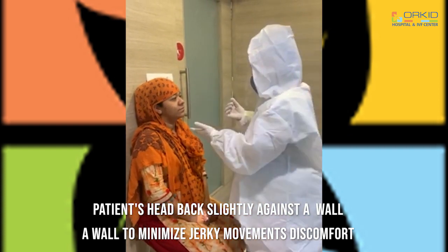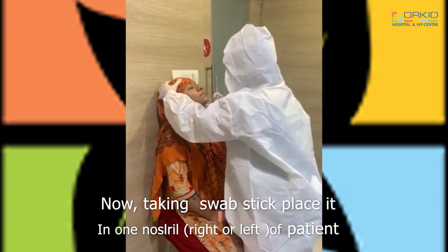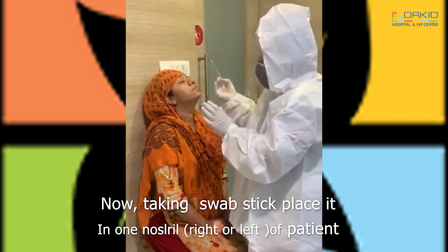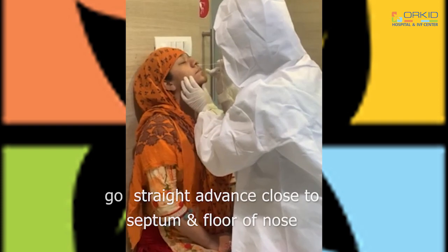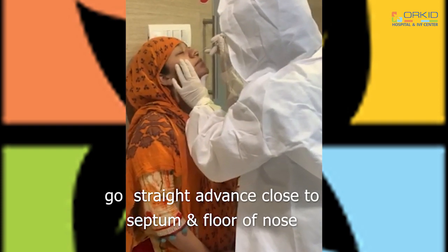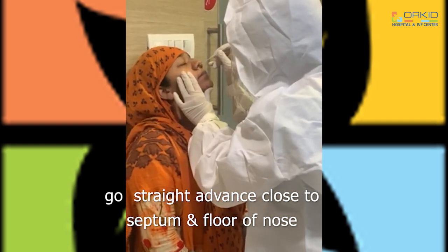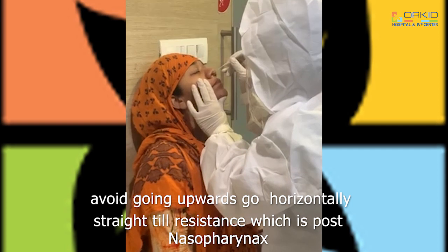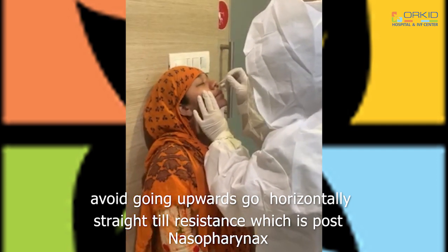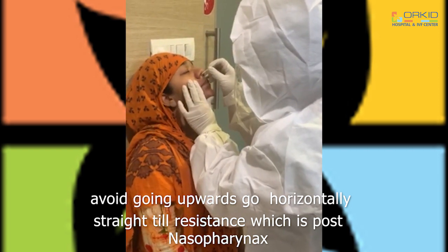Starting the procedure — putting the swab stick, going through one nostril, slowly advancing between the septum and the floor of the nose. Approximately in an adult, it travels a distance of approximately 5 to 6 cm. Resistance is felt when it touches the posterior nasopharynx.